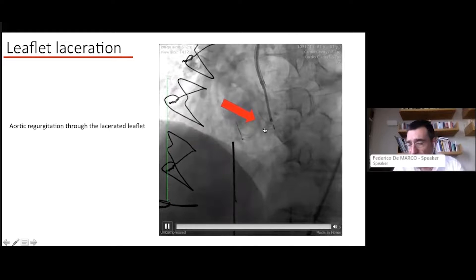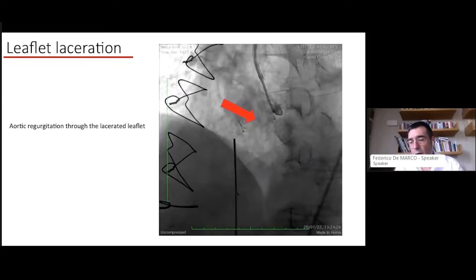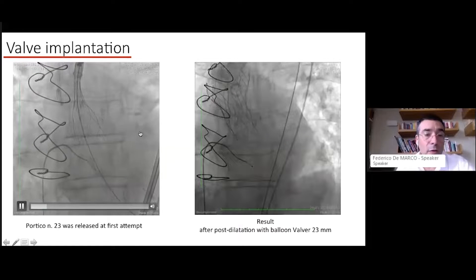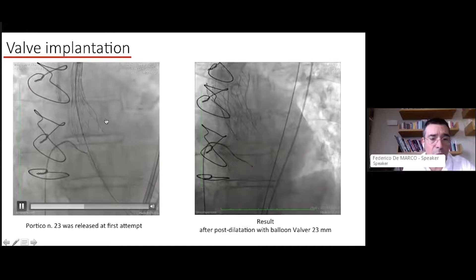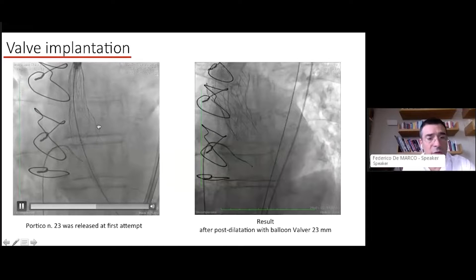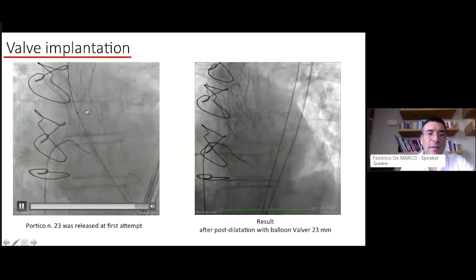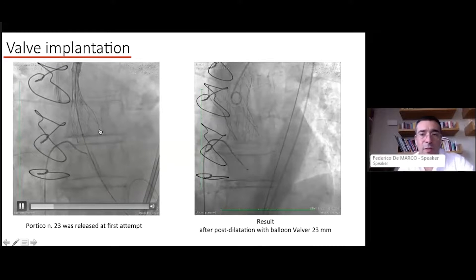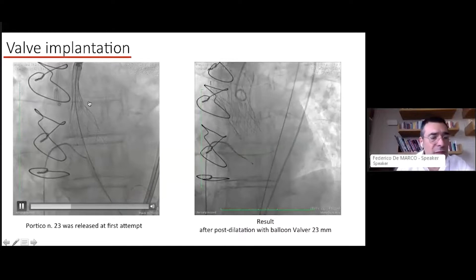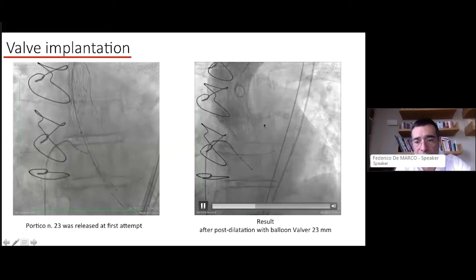By injecting contrast, you can see that the laceration was successfully created — you see some aortic regurgitation at this stage. The patient is usually hemodynamically stable, though occasionally not, which is a rare occurrence. After this, you are ready to implant your TAVI device. For valve-in-valve cases, we have extensive experience with the Portico system — it has minimal metal, provides nice gradients, and allows easy reaccess to the coronary arteries through the wide cells.